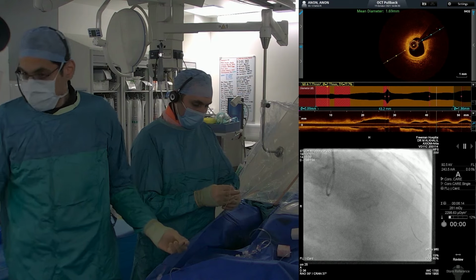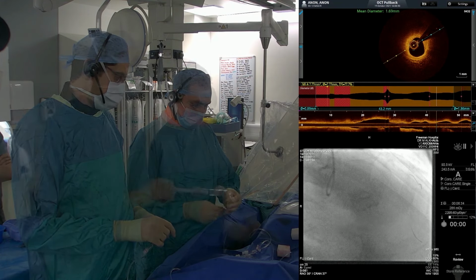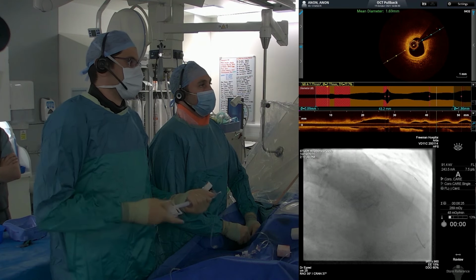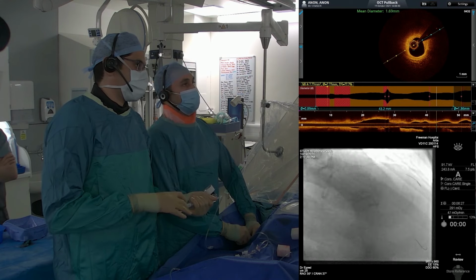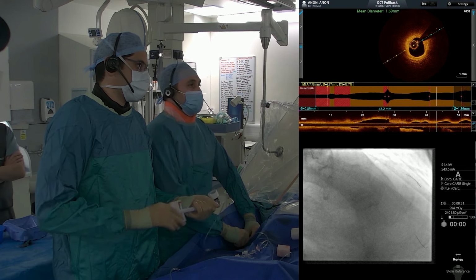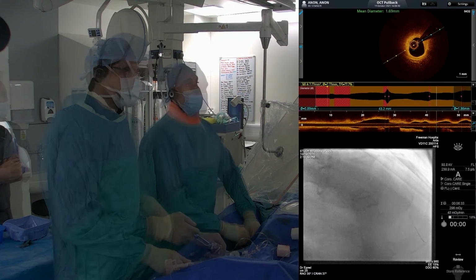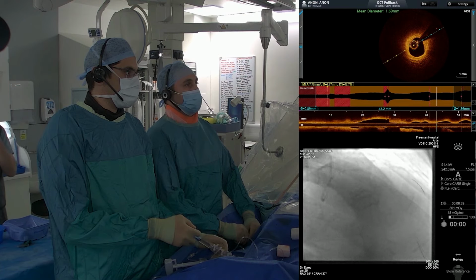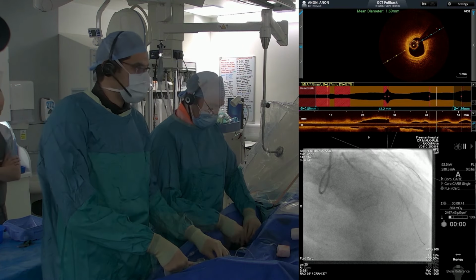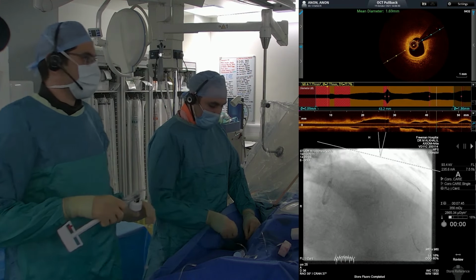So this is a 3 by 15 Prevail drug-coated balloon. Okay, and it slid nicely. What was the deliverability like, Dr. Alcalil? It's very good. Actually, I didn't say. That's all right. Yeah, and we'll go up to nominal, and we'll leave it up for 1 minute. Okay, store that. Good. Yeah, that's good. So we don't have concern about the expansion of the balloon.